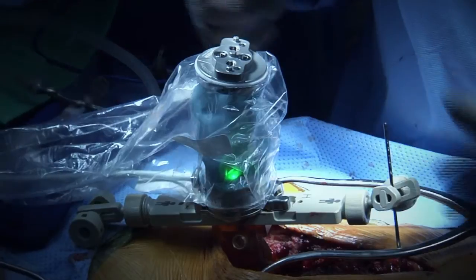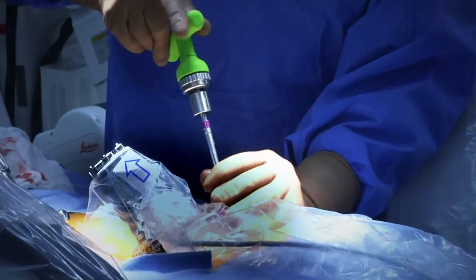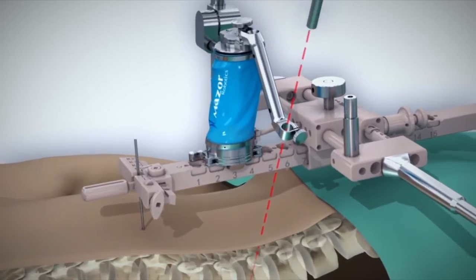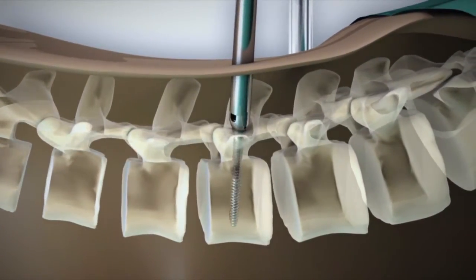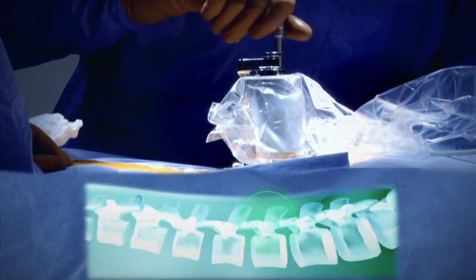This process continues until all trajectories are reached and implants are safely placed in their planned location with one millimeter accuracy, without additional fluoroscopies, thus saving time and minimizing radiation. This whole process ensures the highest level of precision for each surgical action.